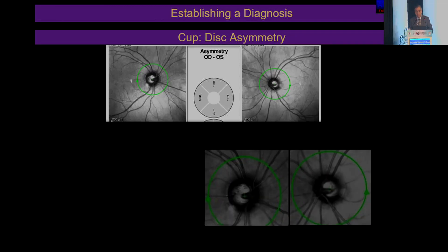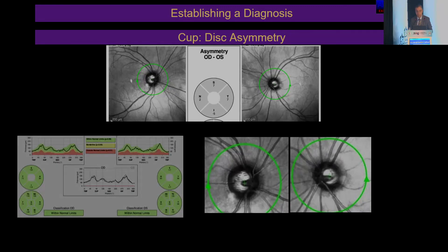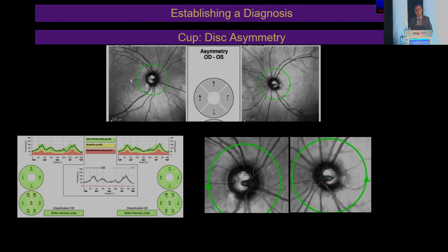OCT can bring these two discs side by side. You know, when you examine one eye, by the time you cross the nose and go to the other eye, you have forgotten what the size of the cup and disc is. So this is the only place you can see how there is a difference in the size of the disc — that's why there is a difference in the size of the cup. The OCT will tell you it is all normal, so look at the least colorful part to confirm it is indeed symmetrical.